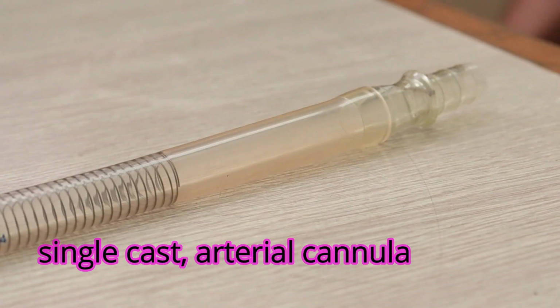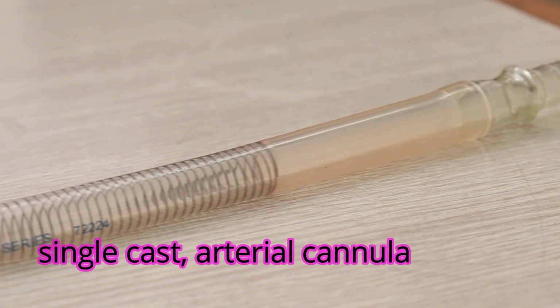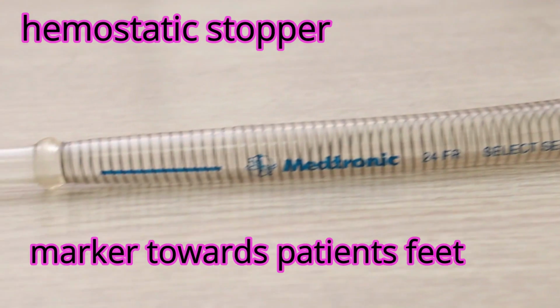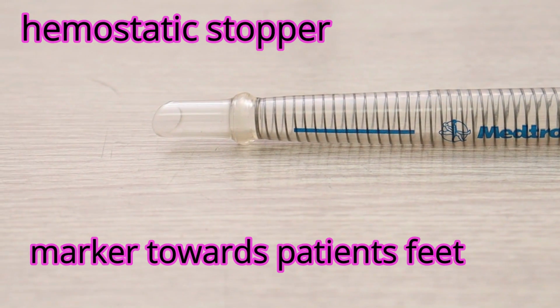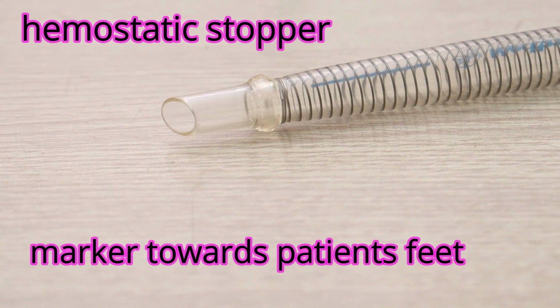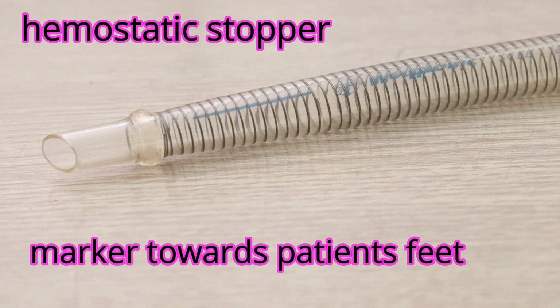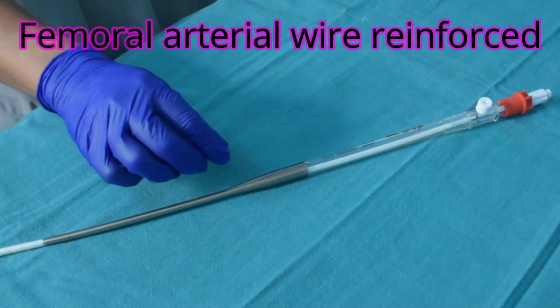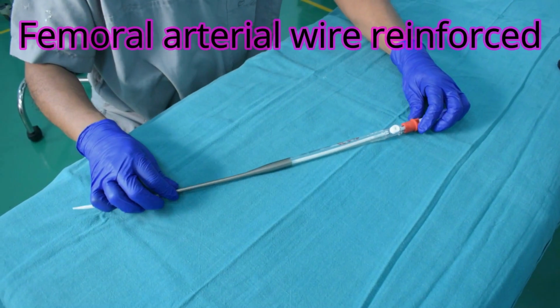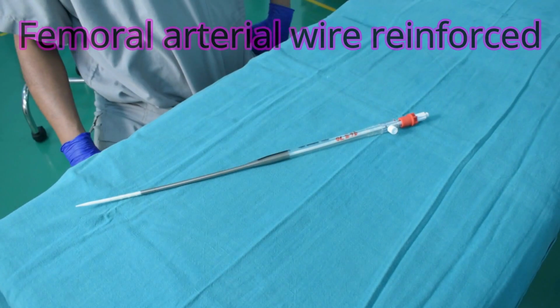Any cannula that is wire reinforced allows you to give a larger room within the cannula, a thinner wall, kink resistant. That's all the advantage of wire reinforcement. Thin walled, larger room, kink resistant. And as the patient gets rewarmed, the cannula gets supple and more prone to kinking. So wire reinforcement helps in the cannula not getting kinked.